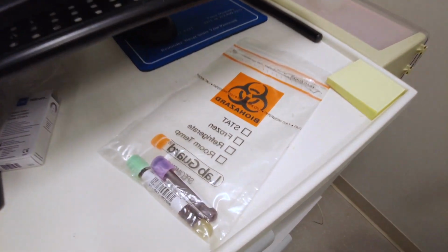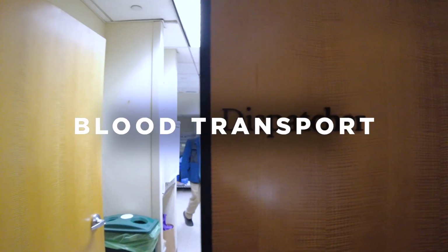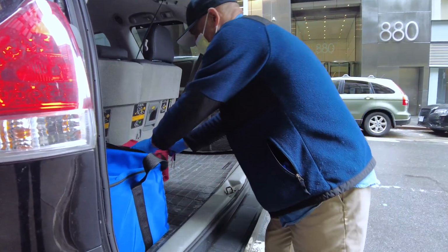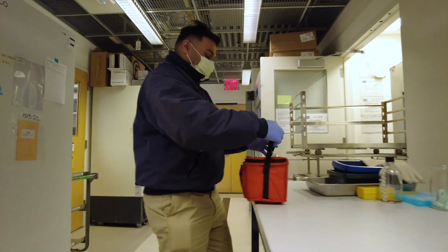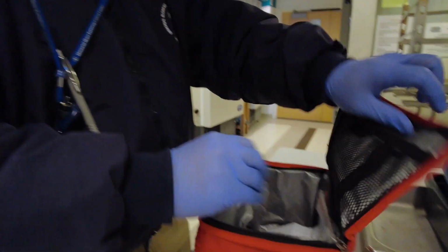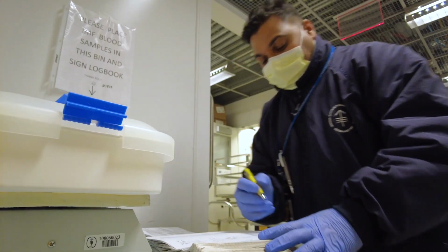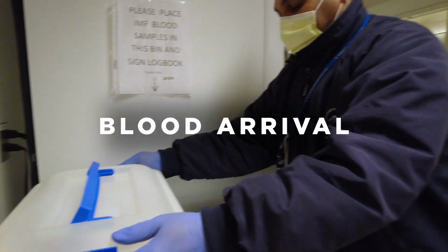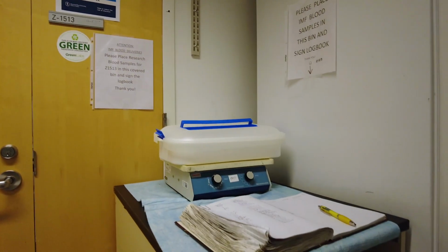The phlebotomist records what time the blood was drawn on the requisition form. The blood sample and the requisition form are then delivered by stat messenger from the clinic to the lab. The messenger notes the drop-off time, which allows the lab member receiving the sample to know how much time has elapsed from when the blood was drawn and when it arrived at the lab. This is important because if there is a delay in the sample arriving at the lab, that can impact the integrity of the sample.